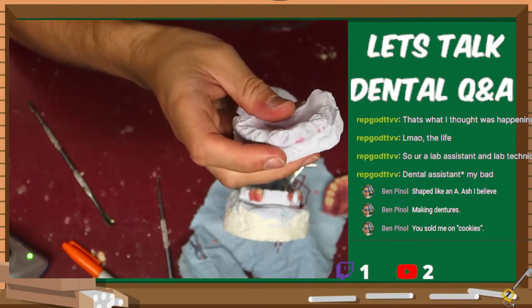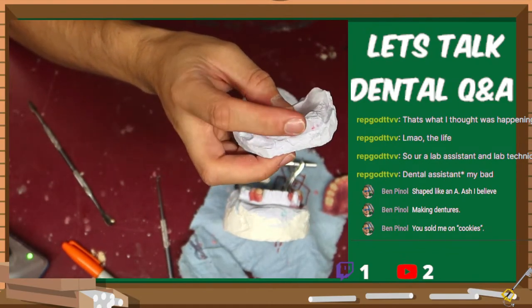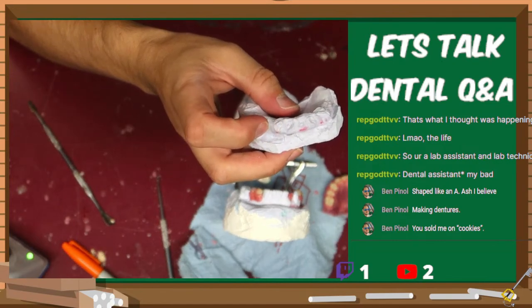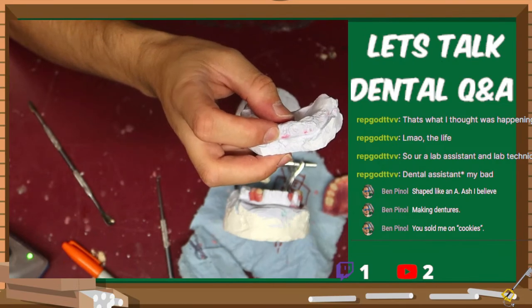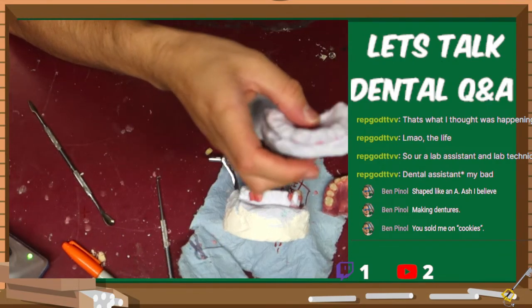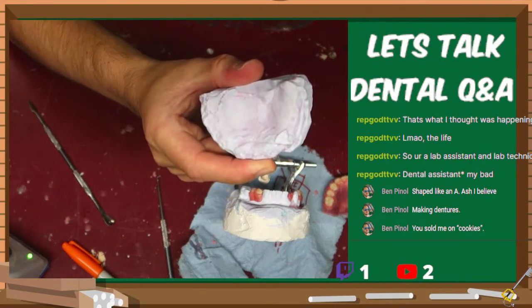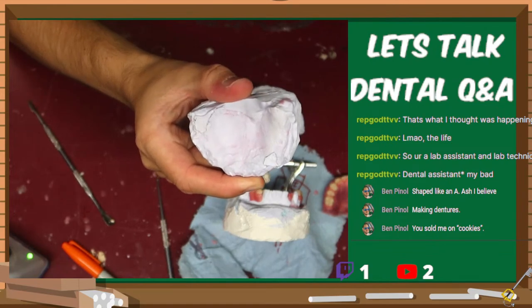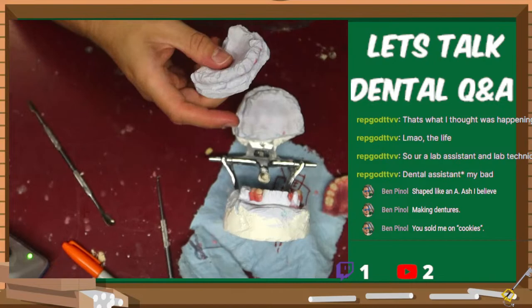something like this, which has no teeth, and it looks like everything's broken off. A lot of these little empty areas are broken-off root tips of teeth that are going to be taken out before they give this denture to that patient. So this is an in-progress procedure that the doctor's doing alongside me. So that's also another case.